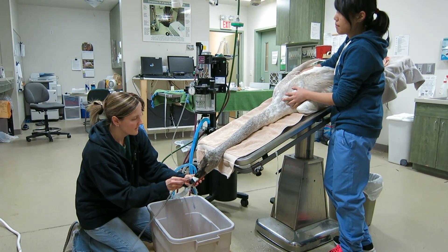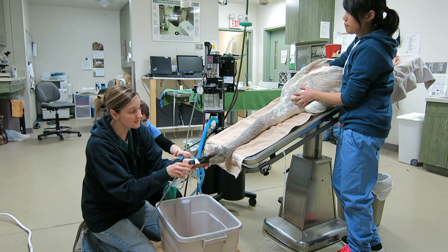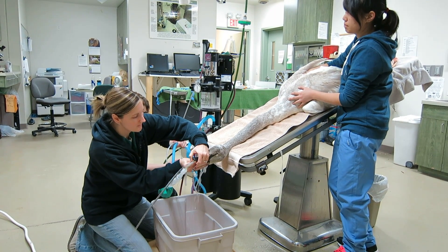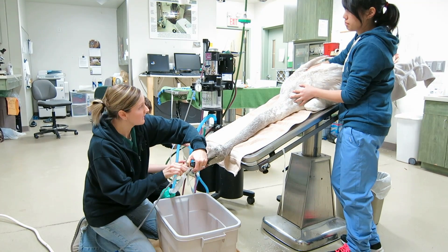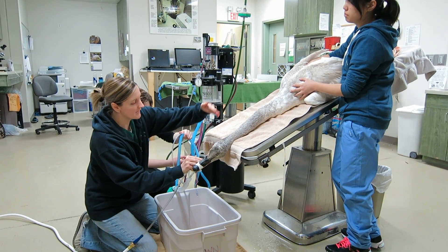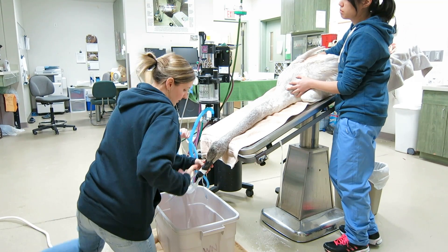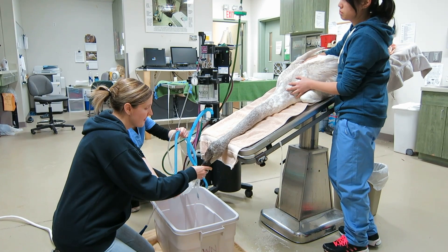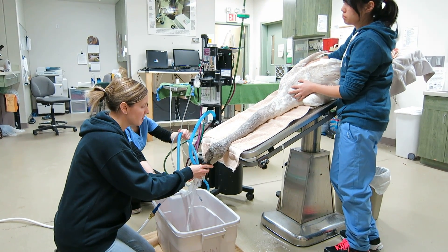What we're going to do is place this tube into the swan's stomach. We've got some warm water flowing through the tube — water is going to fill the stomach, and then we've got the swan tilted downwards so that everything is going to retrograde and come back out. The hope is that the water will mix with everything in there — there's some food in the stomach as well — and then things will start coming back out, including hopefully the lead pieces.